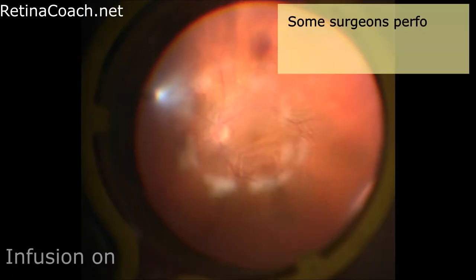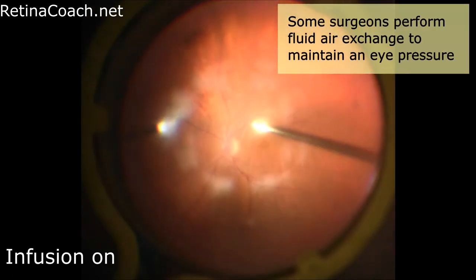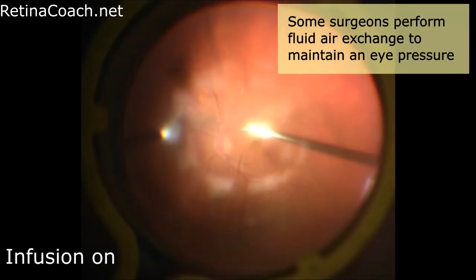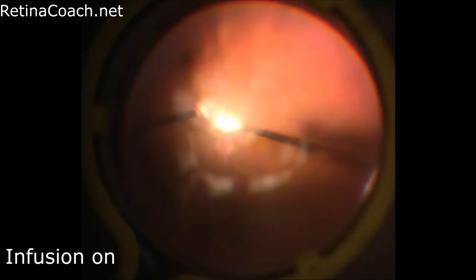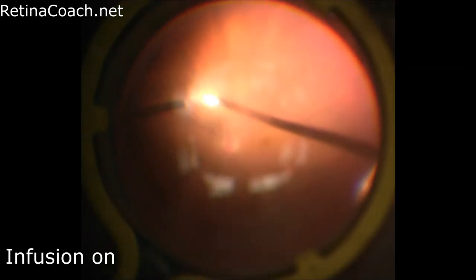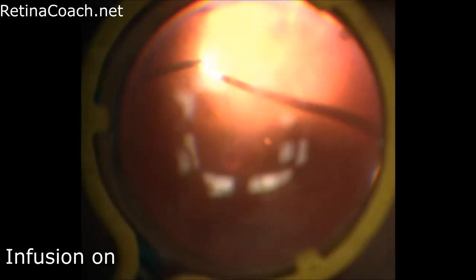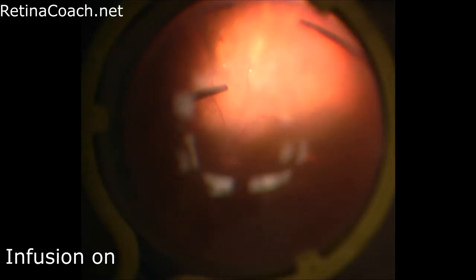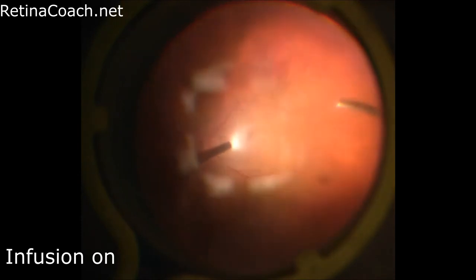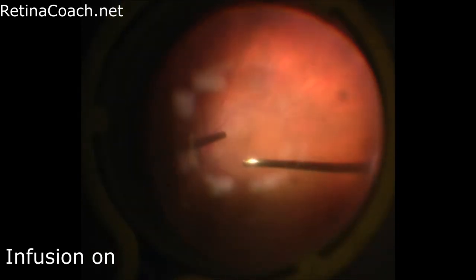Some surgeons perform fluid-air exchange to maintain eye pressure while taking an undiluted sample. But air in the phakic eye may create lens feathering, which may alter further visualization during the surgery. Additionally, air removal increases the duration of the surgery.